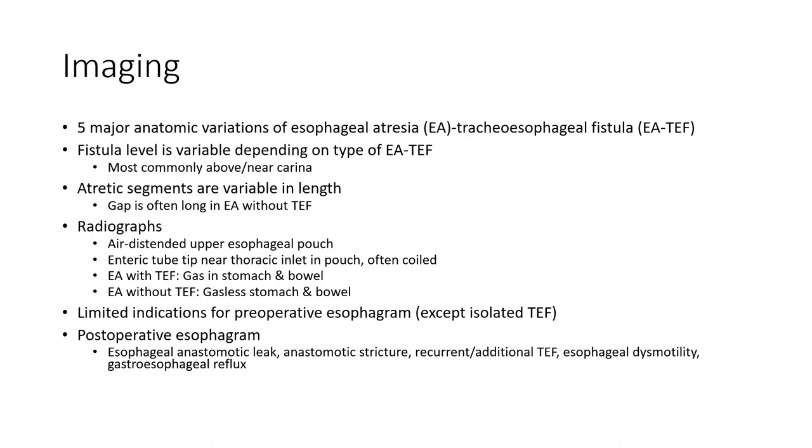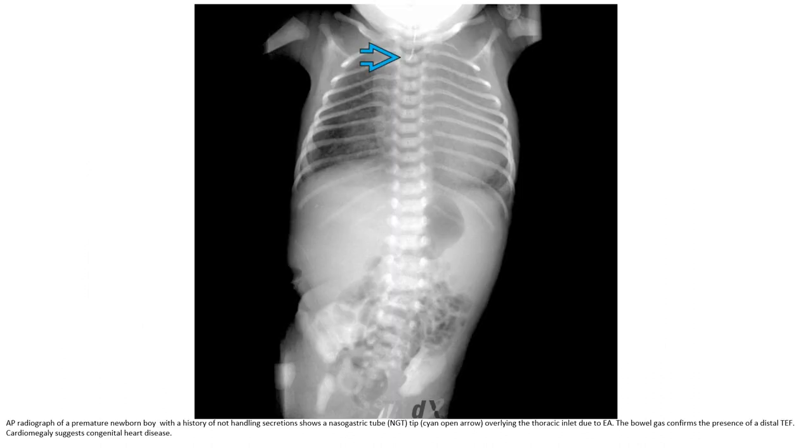Postoperative esophagram: esophageal anastomotic leak, anastomotic stricture, recurrent or additional TEF, esophageal dysmotility, gastroesophageal reflux.